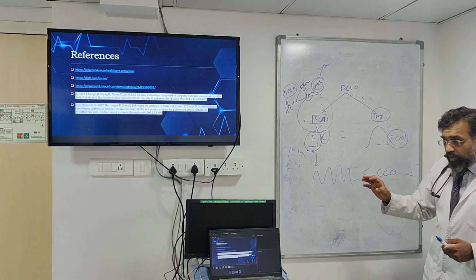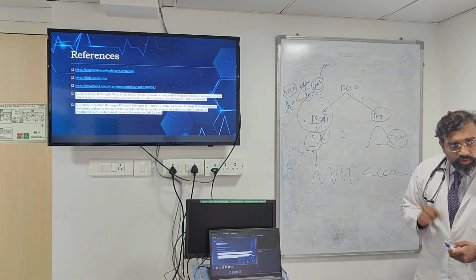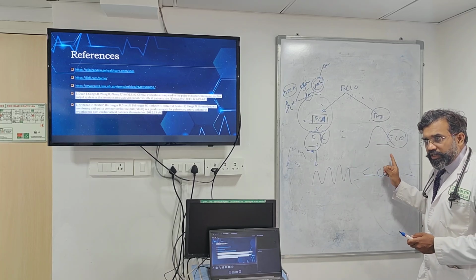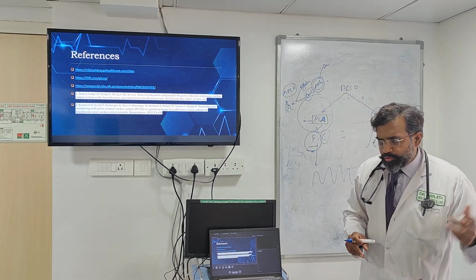Looking at this, when do you think? Now, we've understood that this continuous value is coming only because at that given moment you've done a thermodilution, and that thermodilution is telling you that this is your continuous cardiac output. So when should you do it?